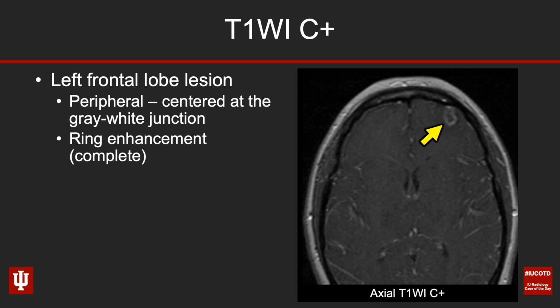And importantly, this has a ring of enhancement surrounding it. This is a complete ring of enhancement. You could take a pencil and completely trace around that ring of enhancement in this case.